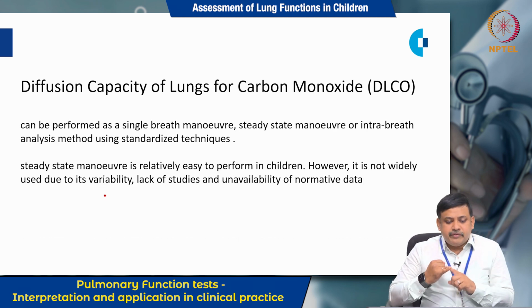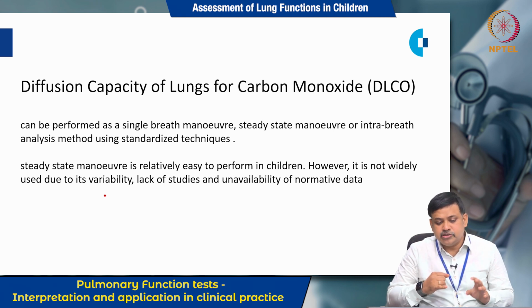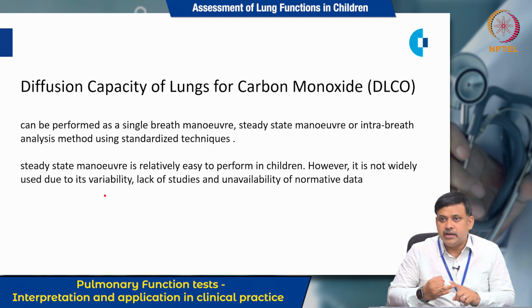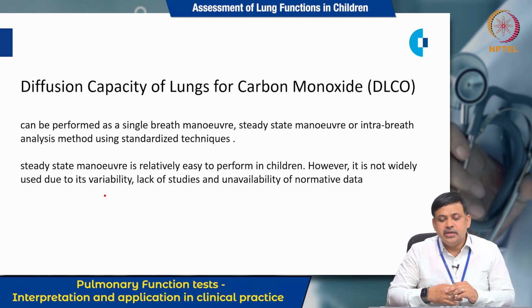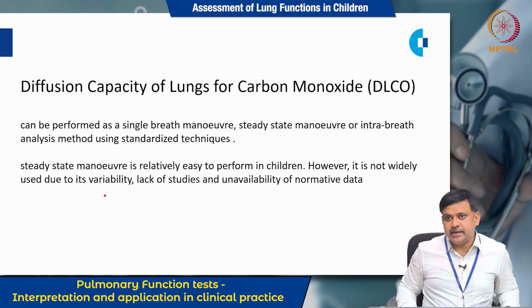This can be performed as a single breath maneuver, steady state maneuver or intra breath analysis method using standardized techniques. So, 3 maneuvers are done. Steady state maneuver is relatively easy to perform in children. However, it is not widely used due to its variability, lack of studies and unavailability of normative data.